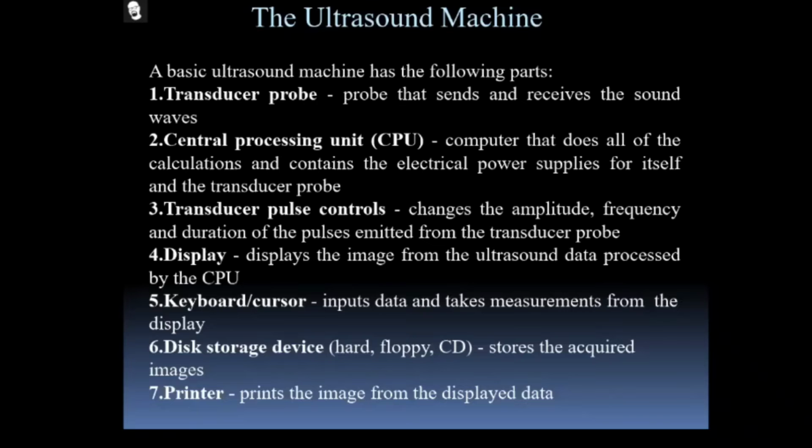For example, if you go to a specialty hospital or general hospital that does not have an ultrasound machine, they suggest you go to some other scanning center. From the scanning center, we can take the printout and show it to the prescribing doctor. Then the doctor will see the image and advise accordingly. That is why the printer option is also there.